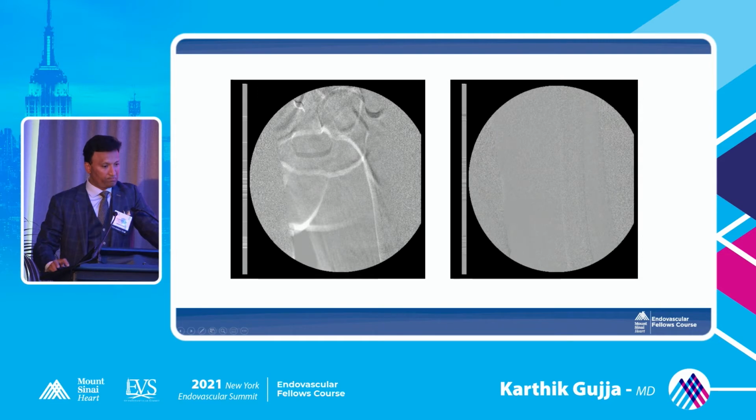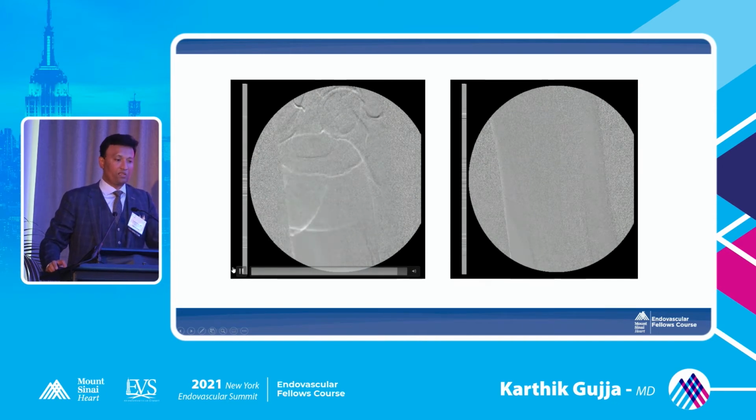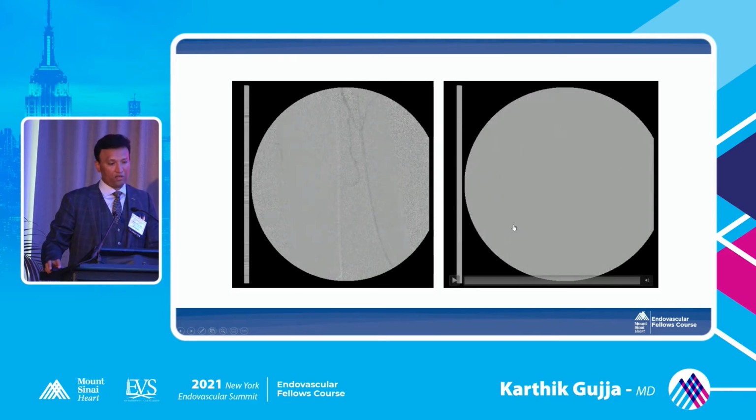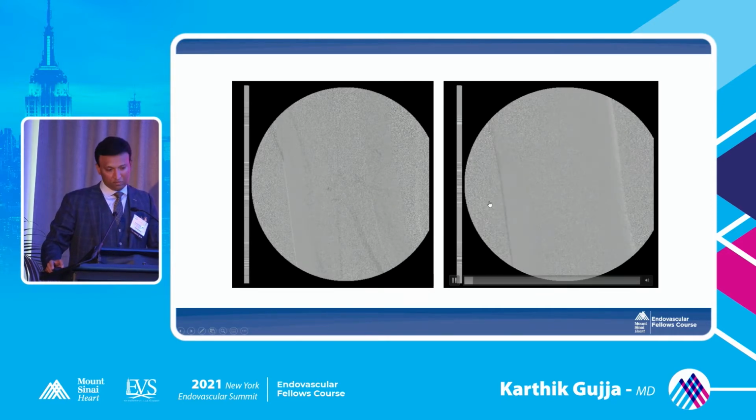So let's go for that. We cross up and over with our catheter. You can clearly see the SFA is diffusely diseased on the proximal end. And when you have diffuse disease like that, it's a total occlusion, you don't know where the stump is. Now you have to look for the reconstitution in the distal end, like you guys know. So we take a long cine, reconstitutes in the Hunter canal, which is a classic CTO case, right? Most of the times after the Hunter canal is where the reconstitution happens through the profunda, classic.